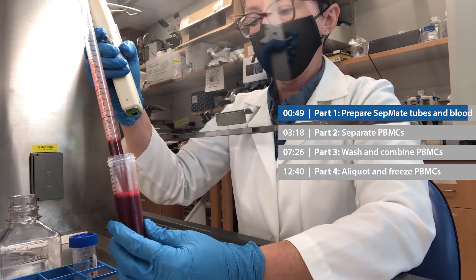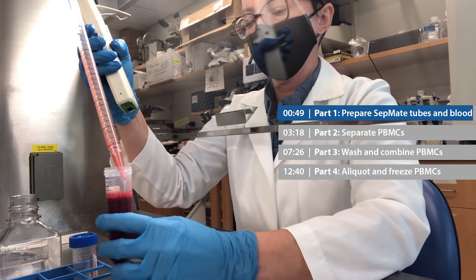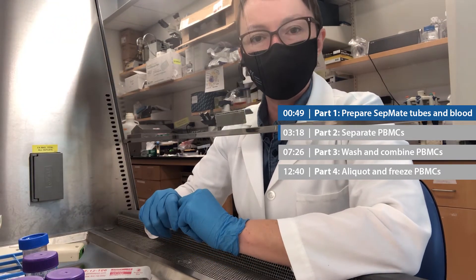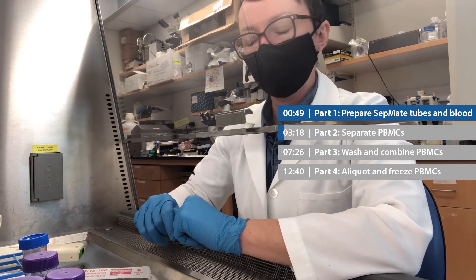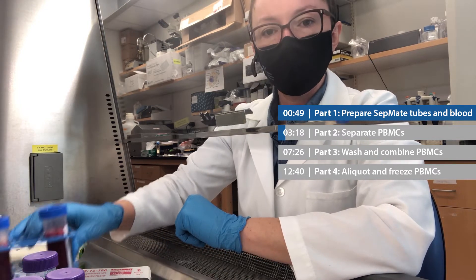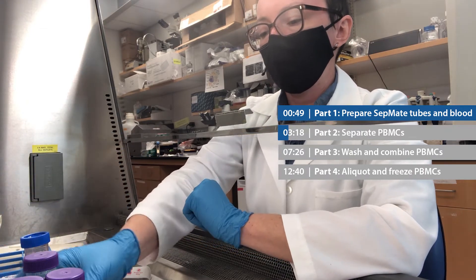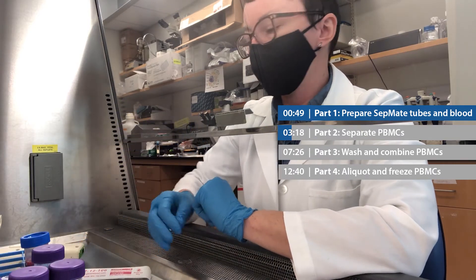Now I'm just going to repeat that same process with the other tube of blood. Now we're ready for part two, and this is the fun part. This is where we get to separate the PBMCs from the red blood cells. You should have two 50 ml conicals with your diluted whole blood, and you should have four SepMate tubes, each containing 15 ml lymphoprep.